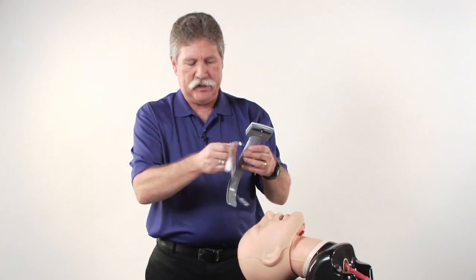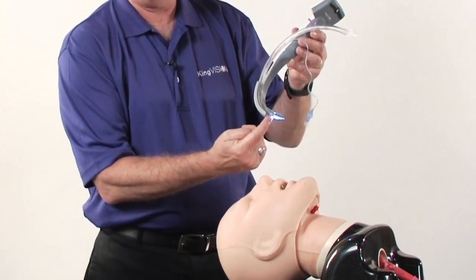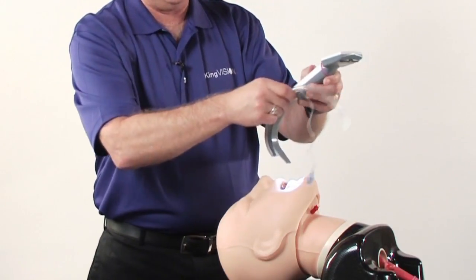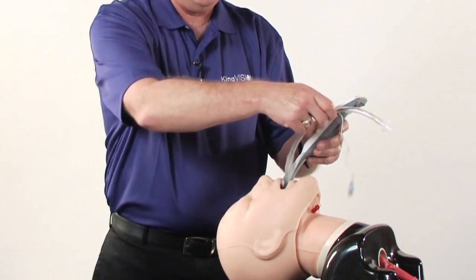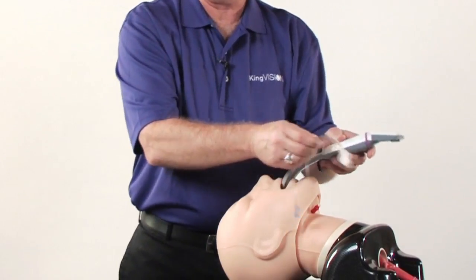Some folks prefer to preload the tube into the channel with the tip right at the end of the blade before introducing it. Others, to avoid this getting into the field, prefer to advance the channel separately and then advance the tube into the channel and into position. Either way is acceptable.